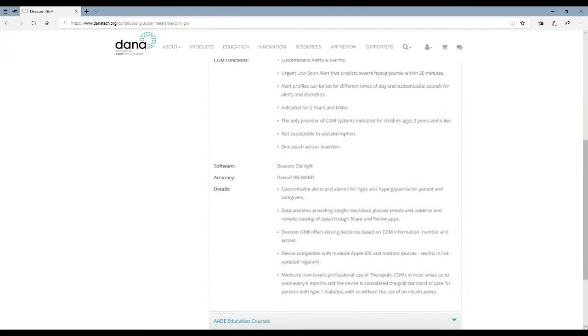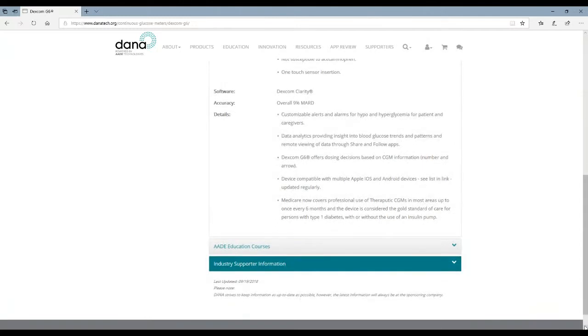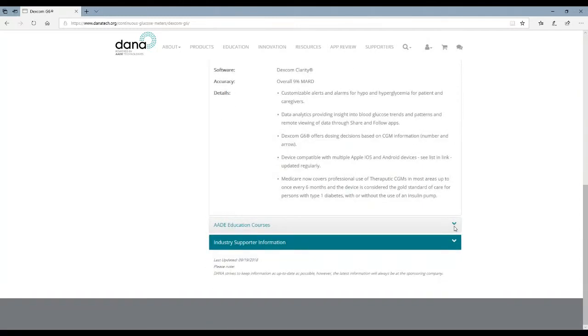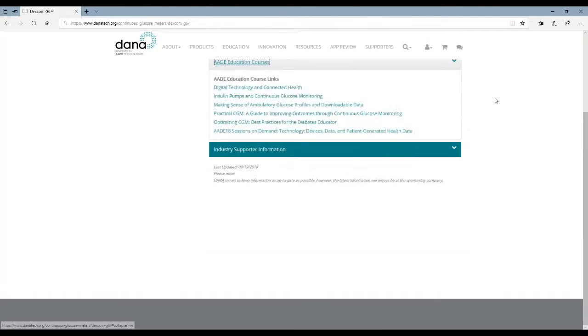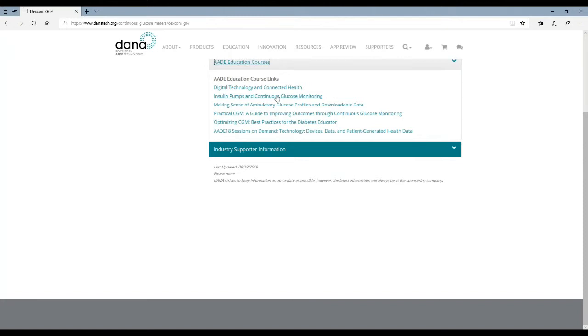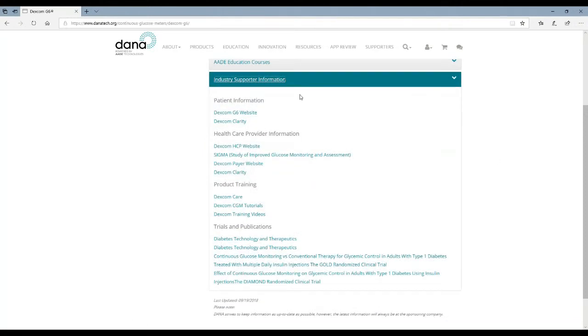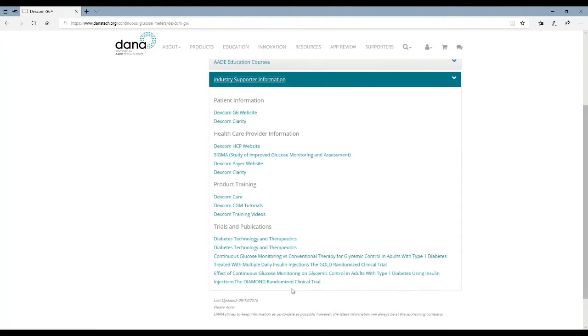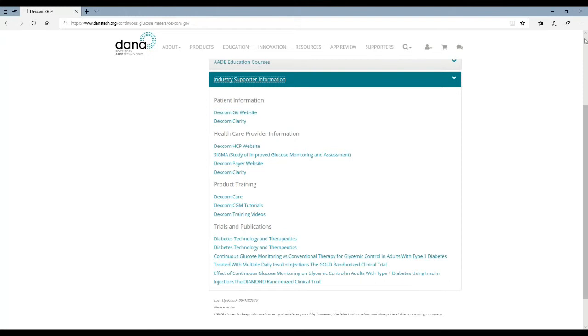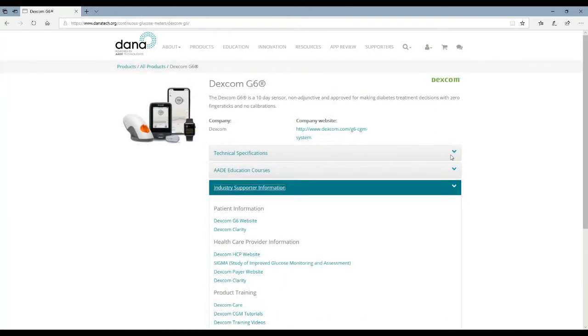As you scroll down you'll get to see all the details, accuracies and other things. Further down you can also see any AADE education courses that are available that have to do with this. In this case we're talking about CGM so there's a lot of courses there about that. And then directly from our industry supporters you'll get links directly to their website for patient information, healthcare provider information, product training, and any trials and publications or product pairings that are available for that product.